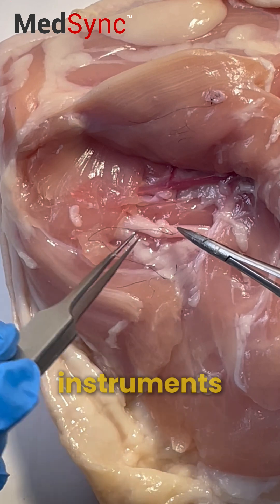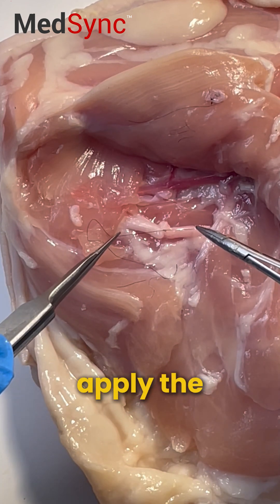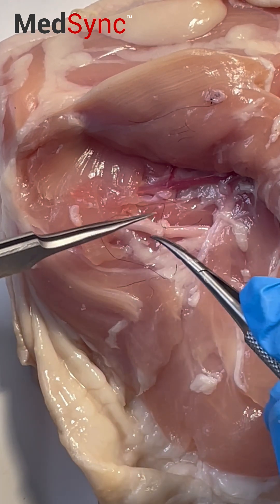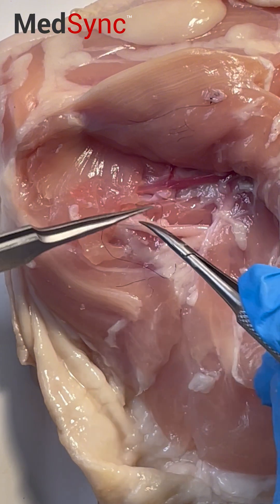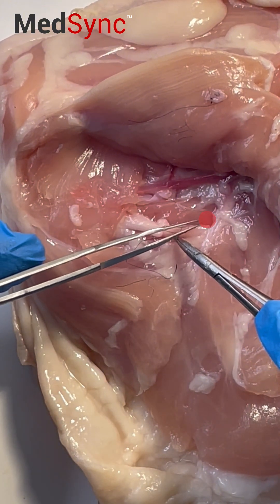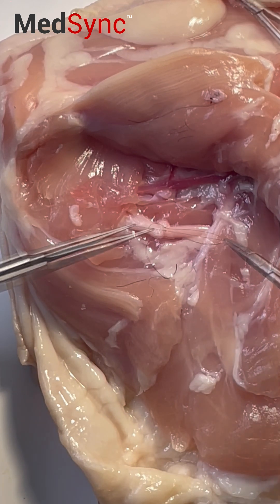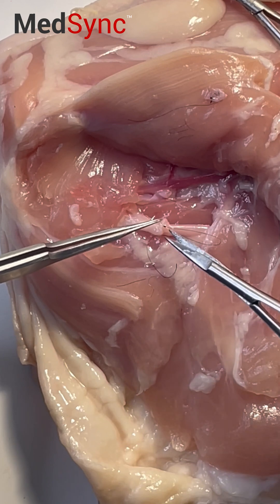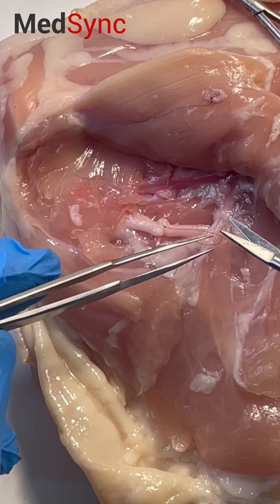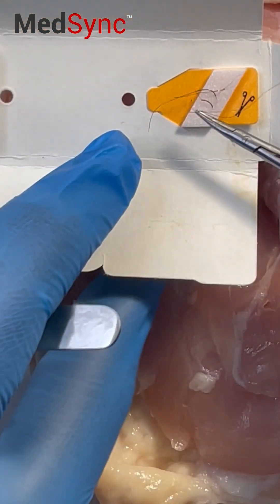Let your instruments be near where you want to tie your knots so you can apply the appropriate tension. Then in reverse: take the long suture with the needle holder, wrap around the forcep, grab the tip of the short suture and tie. I like to cut my short suture first so that I know my needle is secure until I've placed it in the park. And just show me parking it.